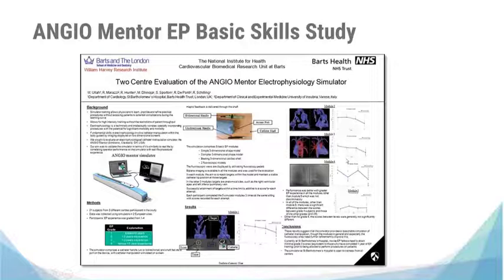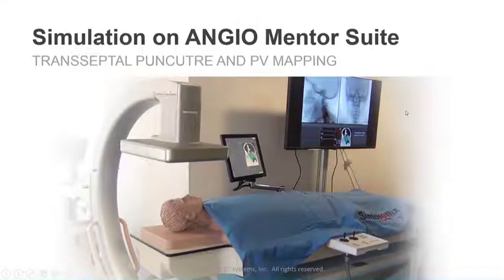And then we were able to demonstrate that the score obtained in these modules correlates very much with the experience of the operator, which means that these modules are very much realistic. And then we defined a minimum score which is required in our center to get to the real patient, to the real procedure, for those who are novice in electrophysiology.